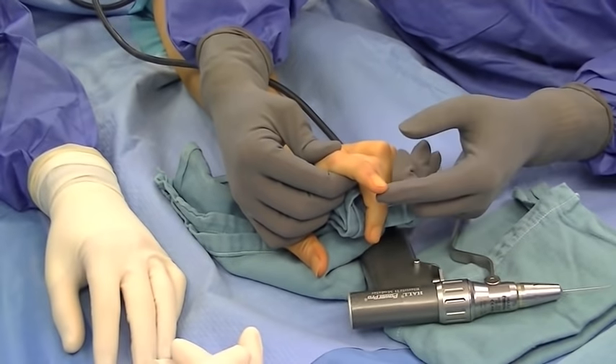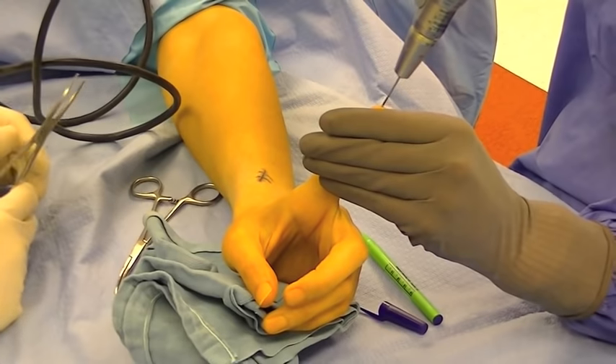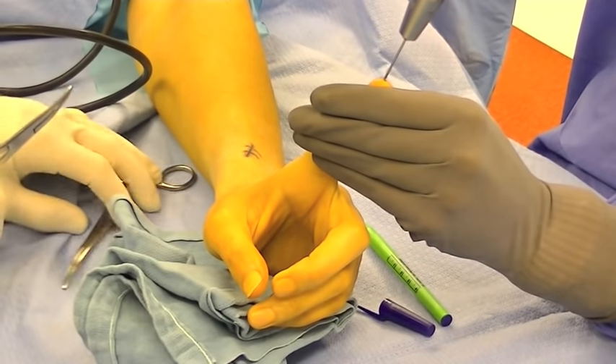Here you can see the droop position of the distal phalanx. An initial Kirschner wire is placed to make sure to gain the longitudinal axis of the distal phalanx.